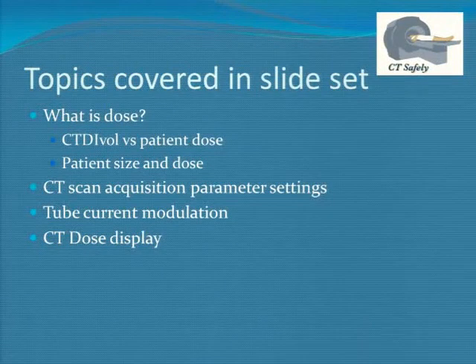So these are the kinds of things that you will find, sort of definitions. What is dose, after all? What is CTDIvol, and how does that really compare to patient dose? There is still a massive misunderstanding that this dose value you see on the screen is actually what the patient is receiving. And we know that's not true. It's what this funky single-size phantom thing is receiving. And so we're trying to get that word out a little bit better.